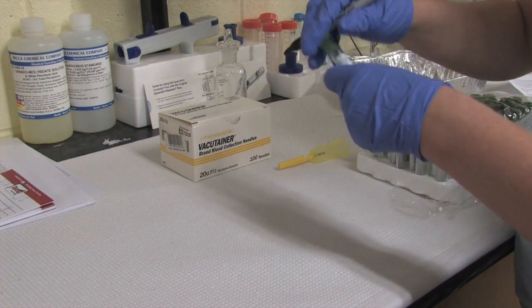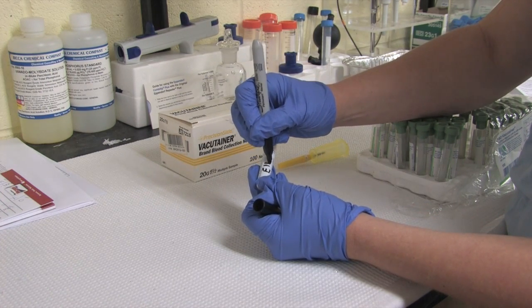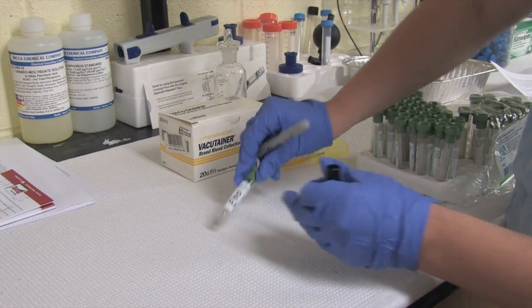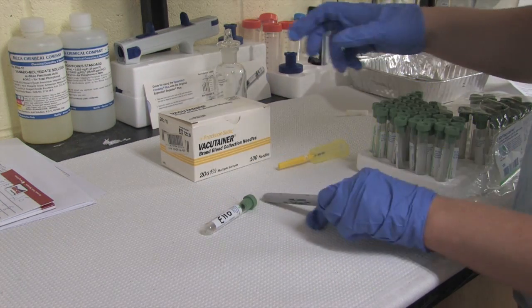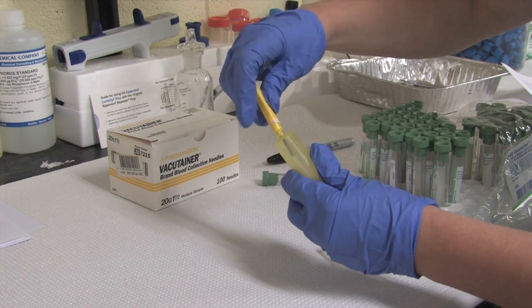Before restraining the animal, mark and label your blood tube with the animal's identification number and secure the vacutainer needle into the vacutainer needle holder.